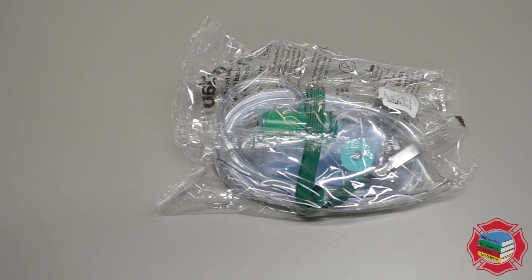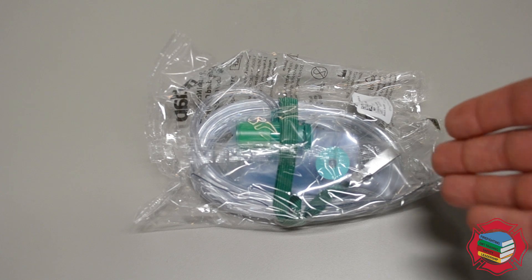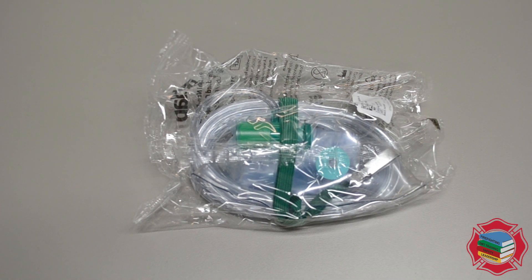Here we have another passive O2 delivery device — this one is your non-rebreather mask. These are single-use devices. We'll run this one from 10 liters a minute up to 15 liters a minute.